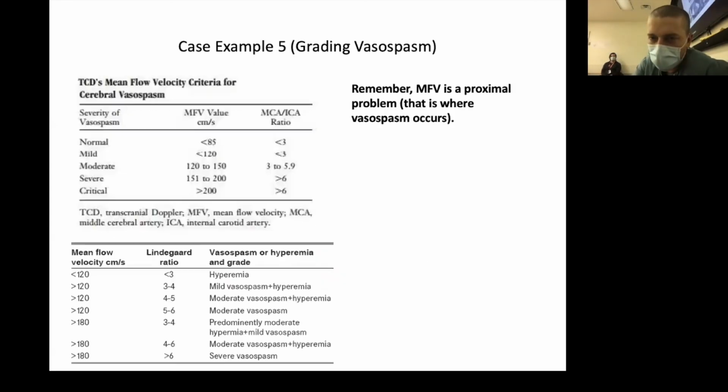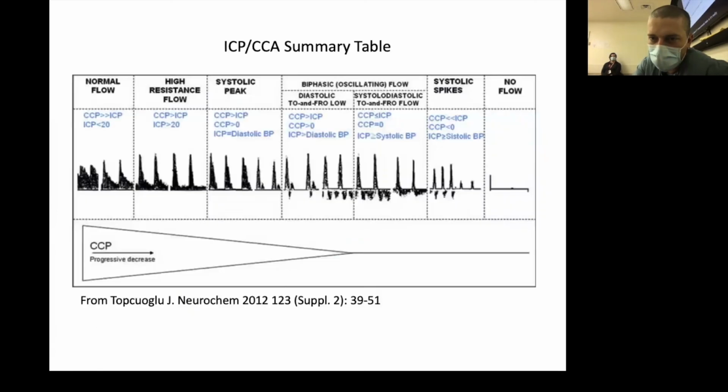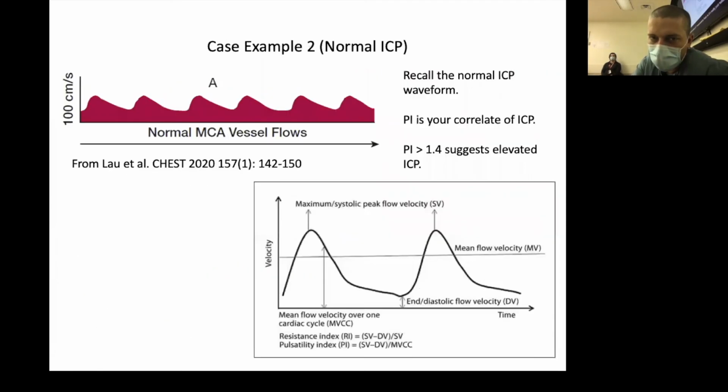Sandy. First of all, yeah. I have a question about ICP measurements. So it's really just telling you if it's high or not. It's not like vasospasm where you can find out mild, moderate, severe, or can you find ranges? Is that specific?